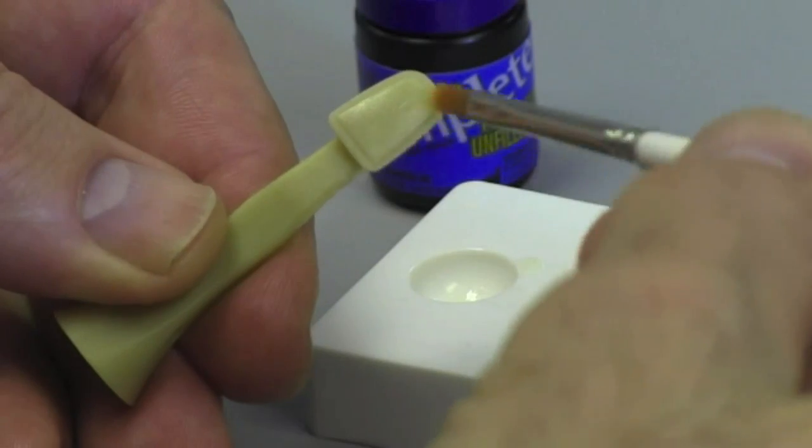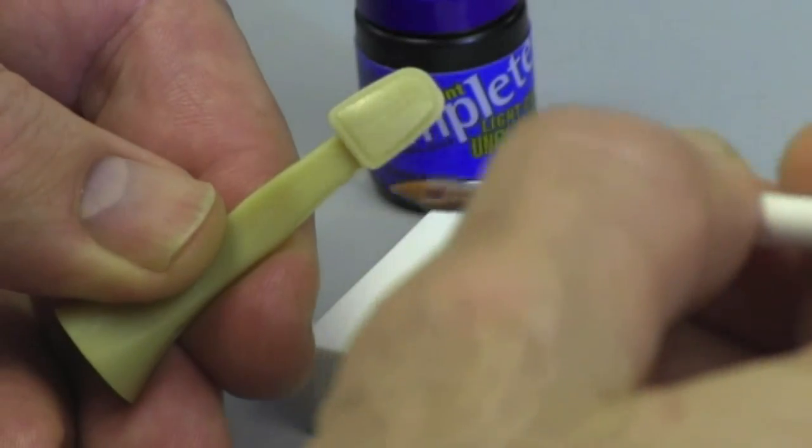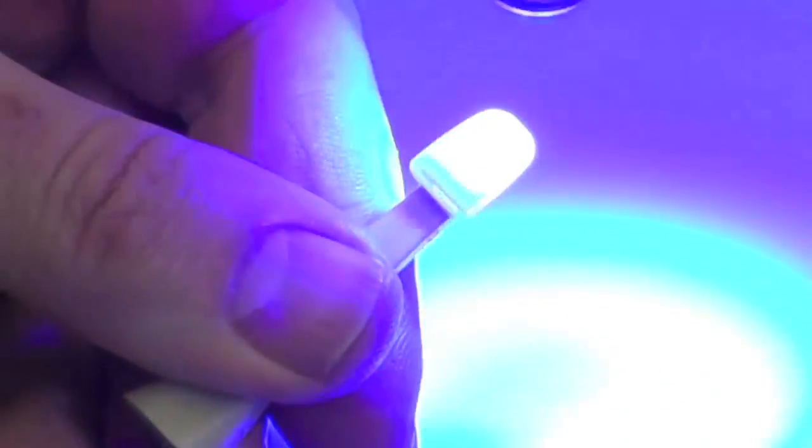In this case, it's unfilled resin. It could be any other adhesive, tints, opakers. Applying this material properly is key before you light cure it.